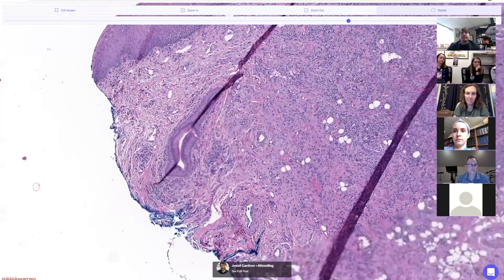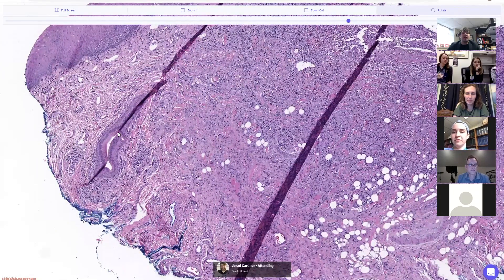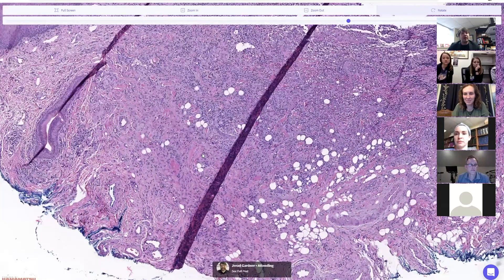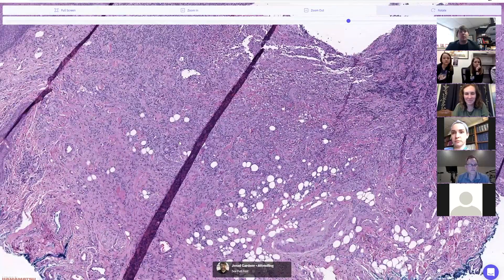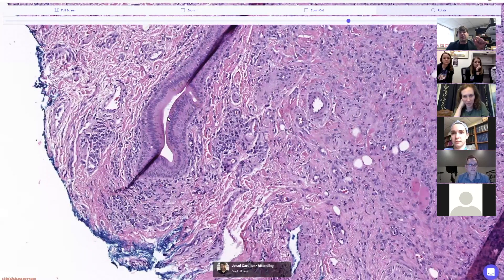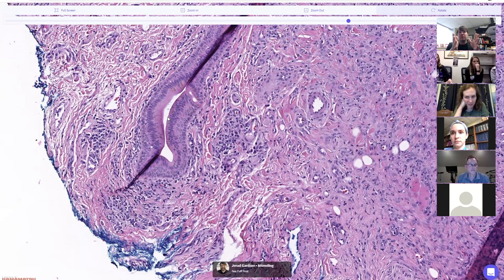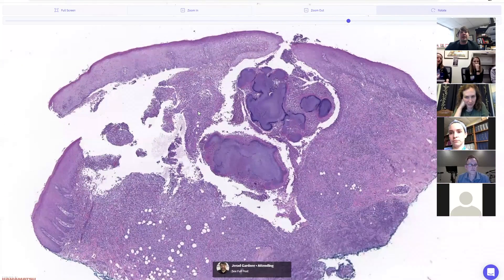This is in the inner lip, although there are some ducts in the female genital area like the Bartholin's gland ducts that may look similar. When we see double-layer cuboidal to columnar duct structures, the two things I always think of are sweat ducts, which are double-layer cuboidal, and salivary gland ducts, which tend to have this double layering with a columnar lining on the inside. So this is on the lip.